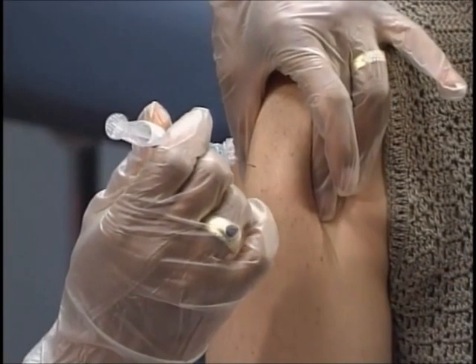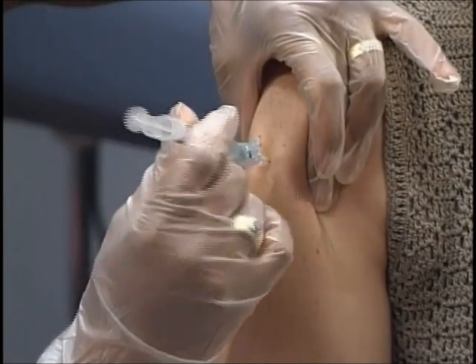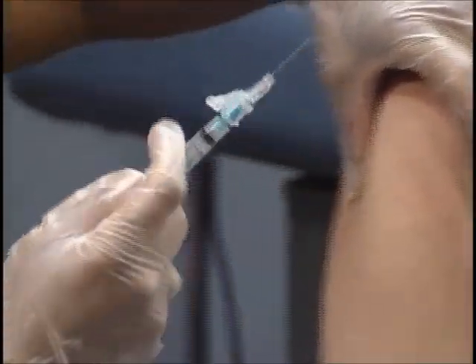Probably the most frequently asked question about giving immunizations is about aspirating. In the past, we were taught that one had to aspirate to be sure the needle was not in a vein before injecting. Some providers aspirate on all injections, and some never aspirate at all when giving immunizations. It takes a certain amount of dexterity to be able to do this with one hand, to do it quickly without moving the needle, and meanwhile continue to control the limb and hold the site with your other hand.